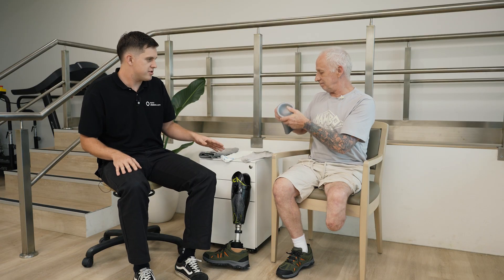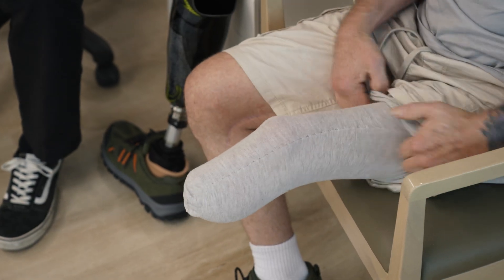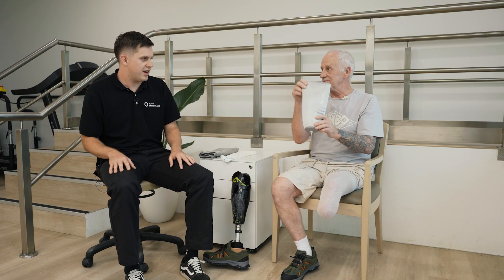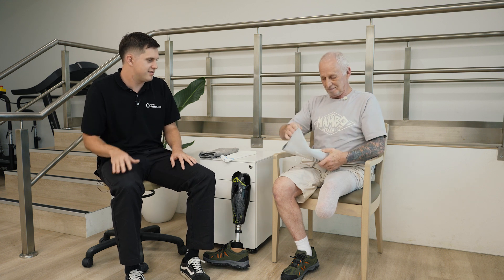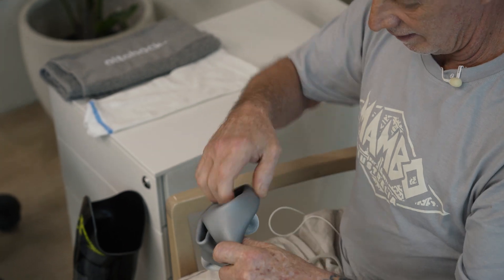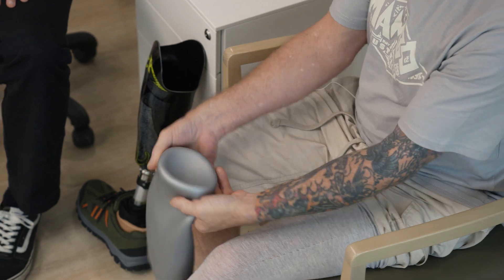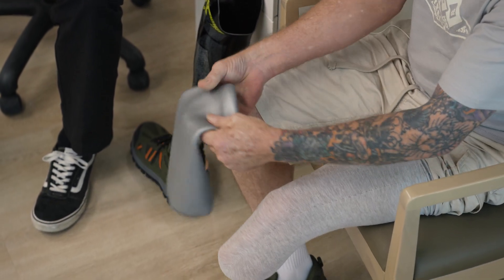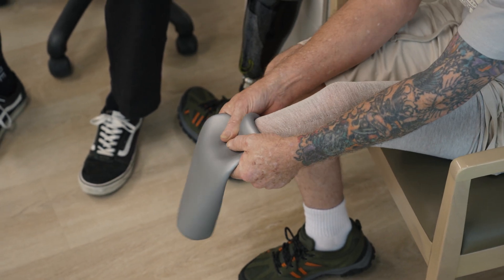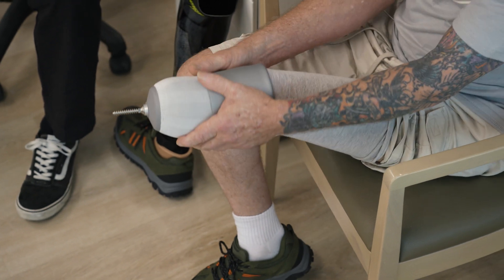Now Bill, I know that you use a sweat sock so I'll get you to pop that one on first. I'll get you to completely invert that one now for me. Now I need to make sure there's no air trapped in the bottom.